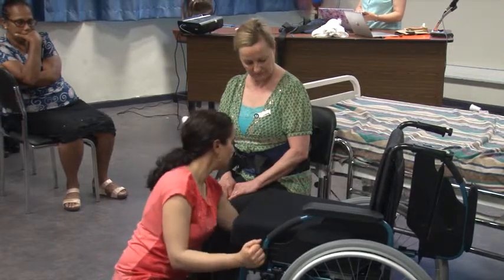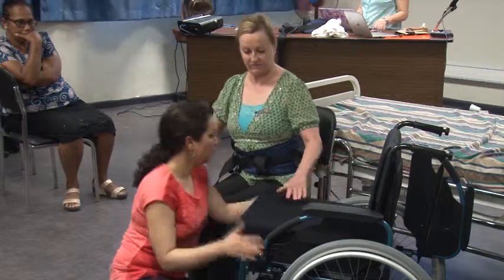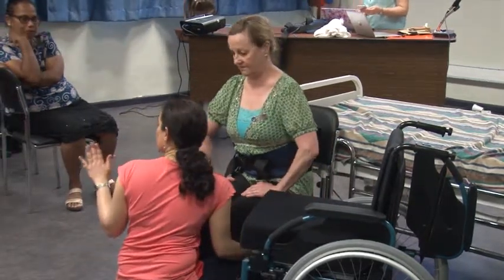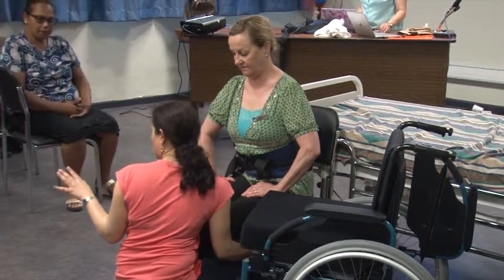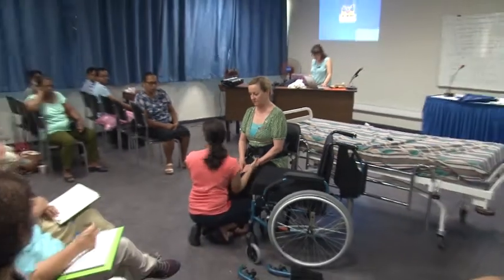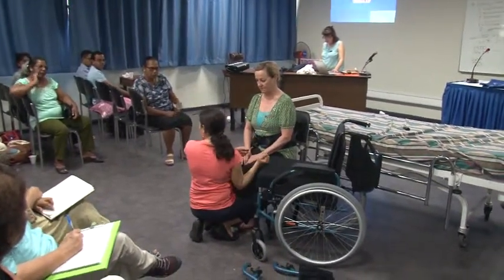Put the brakes on. So, okay. The principle of moving a person is going to be the same as the slide board transfer as well: how you position yourself and how the person is positioned. But here, she's able to lift herself. I'm going to guide her onto the chair.